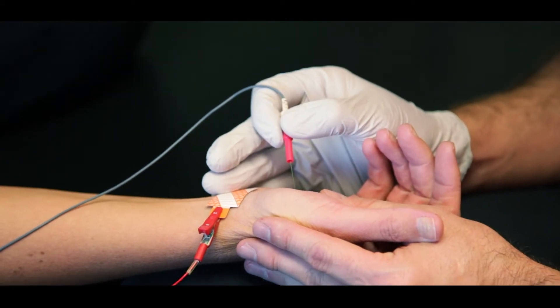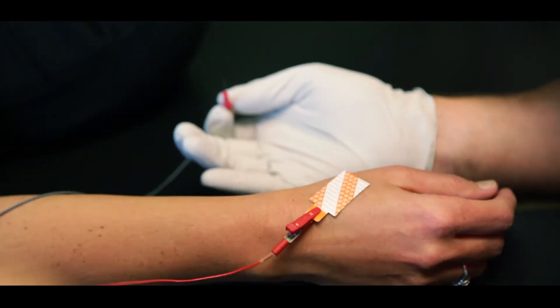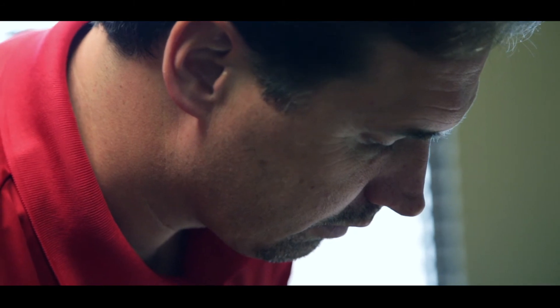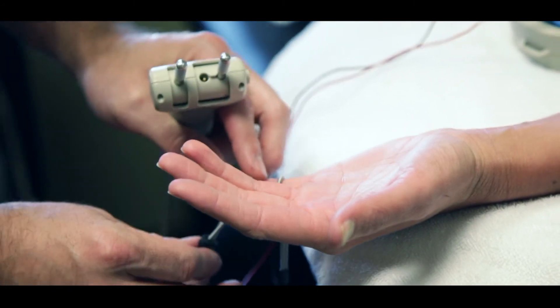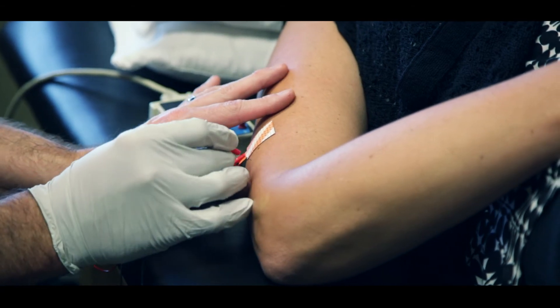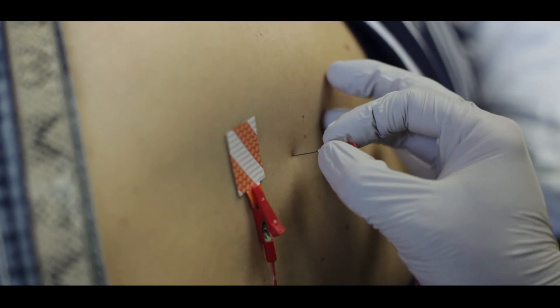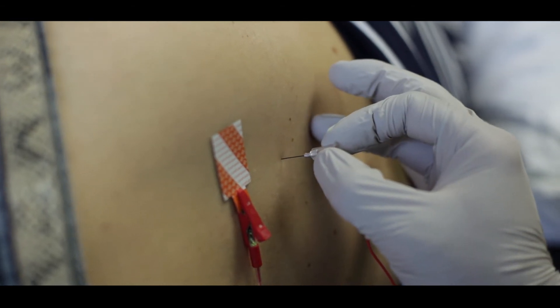Electrodiagnostic testing is commonly used to investigate for symptoms of carpal tunnel, cubital tunnel, cervical radiculopathy, sciatic-type symptoms, as well as what we call a polyneuropathy — when someone has multiple nerves involved, where their feet go numb, their hands go numb, or where they have burning-type pains or sensations.